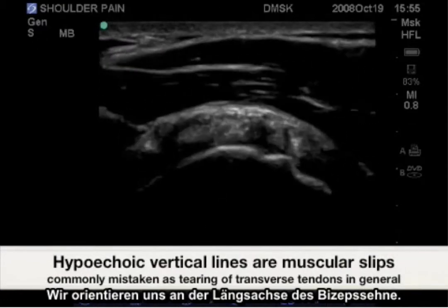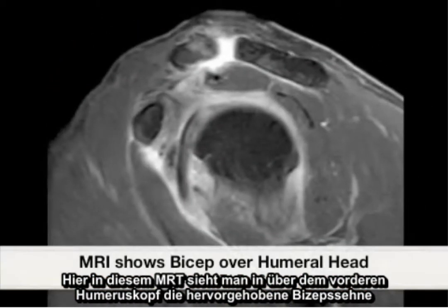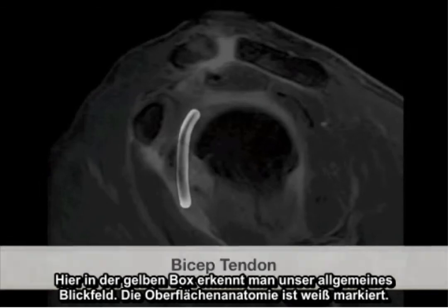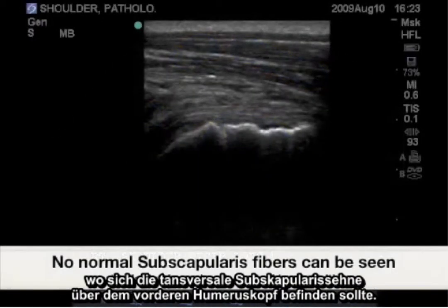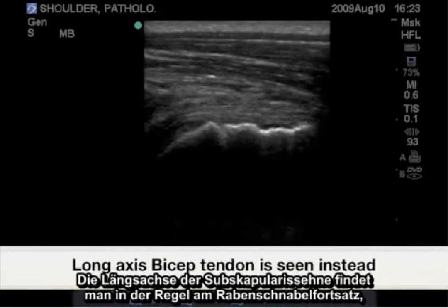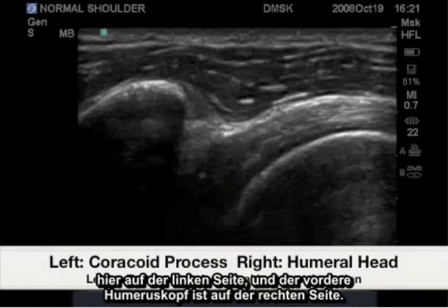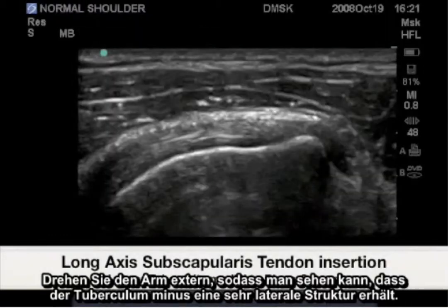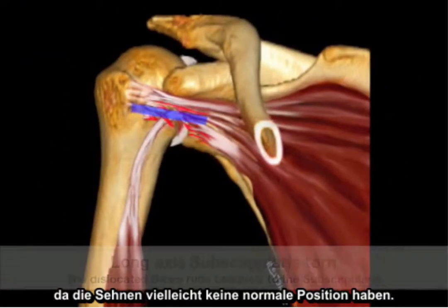We will orient ourselves to the long axis of the bicep tendon. Here in this MRI correlation over the anterior humeral head, we have highlighted the bicep tendon coursing over the humeral head where it should be in the normally situated bicep groove. The long axis of the subscapularis tendon is generally found by locating the coracoid process on the left and the anterior humeral head on the right. Externally rotating the arm reveals the lesser tuberosity becoming a very lateral structure. When pathology presents itself, we must rely heavily on our bony landmarks as the tendons may not be normally situated.